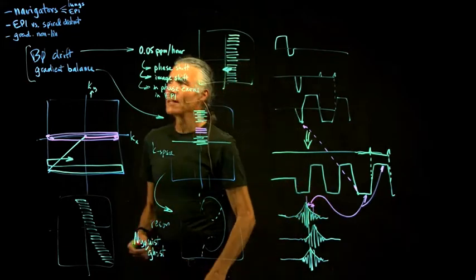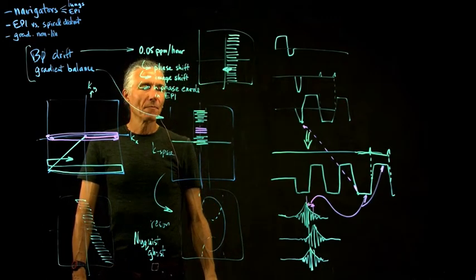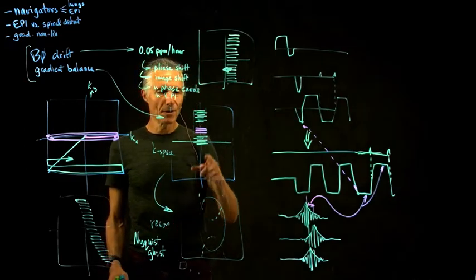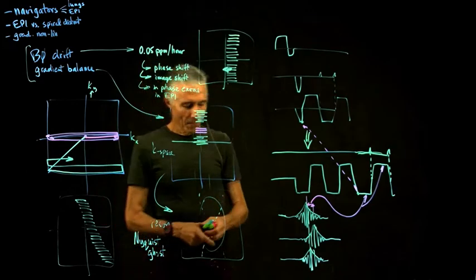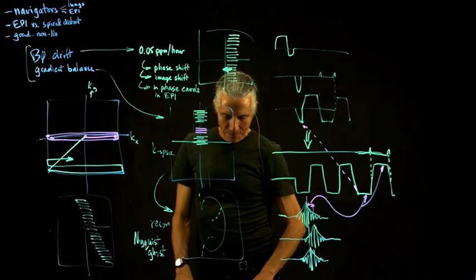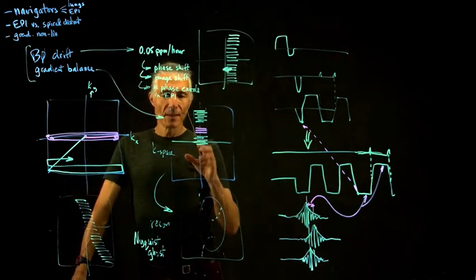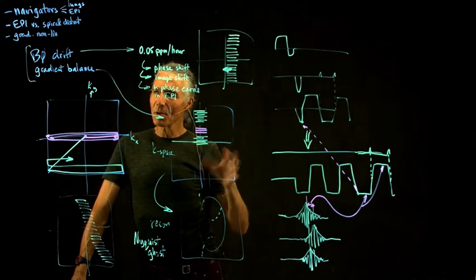So it's something that is a very, very quick and dirty measurement that is then immediately fed back into the scanner in order to collect the rest of the data more reliably. And obviously, one of the things with any kind of scheme like this that you always have to keep in mind is that you've got to be super reliable, because you're actually actively changing the rest of the data collection. And so there's no going back, in a way.